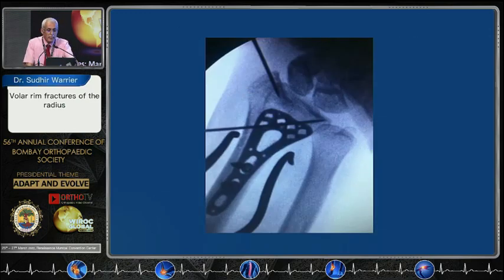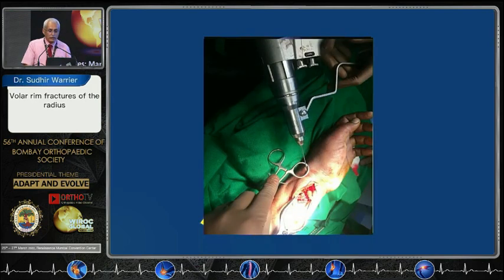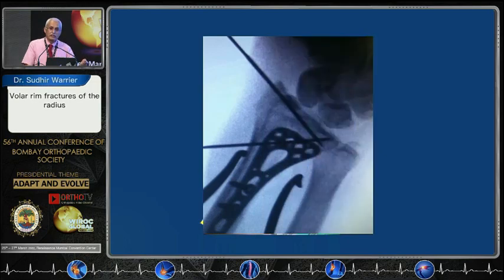Here is the same patient. What I did was put in a plate at the safe place, then got a wire to hold the ulnar side up and then got the other wire in along the articular surface. I want to bend this and pull it across to get the fragment to reduce. I do this while I am drilling — I put in a mosquito forceps. The ring of the mosquito forceps pulls it down, doing exactly what I was doing otherwise, and then I get it driven across. It does not snag on anything — my finger, glove, or gauze — so it is very easy to do this.